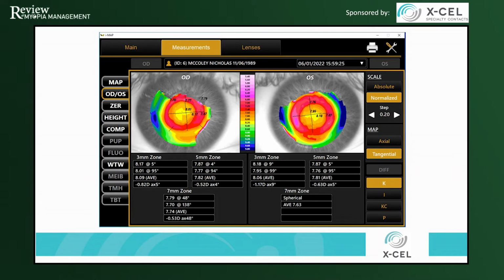And we wanted to adapt it to also be a part of myopia management. And part of what you need when you're designing lenses or when you're utilizing a design is manipulation. So we try to keep it very simple, keeping it a zone aspect fitting philosophy, but the manipulation of those zones is what's important.